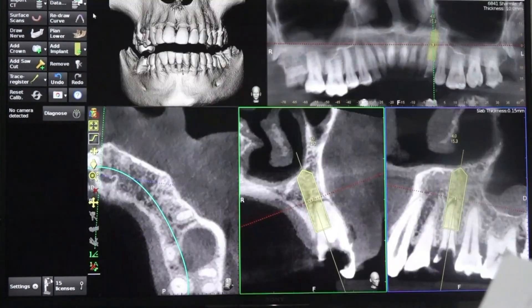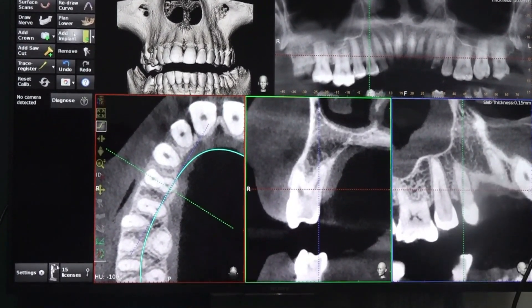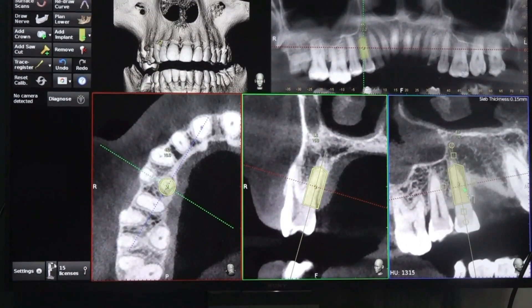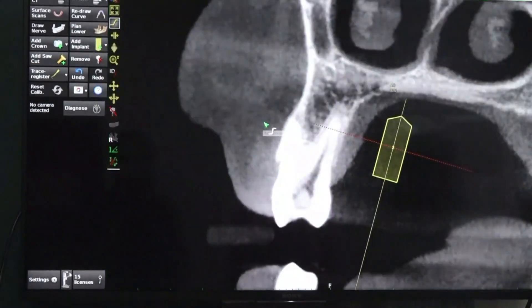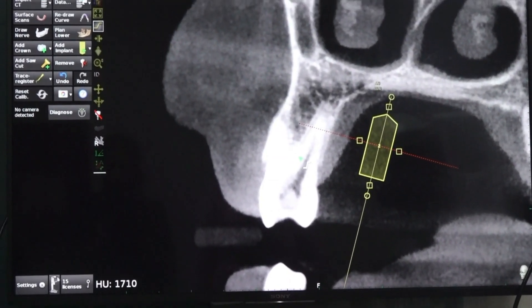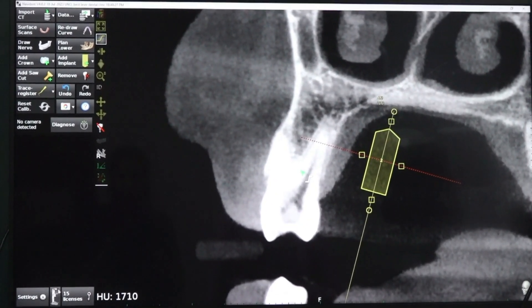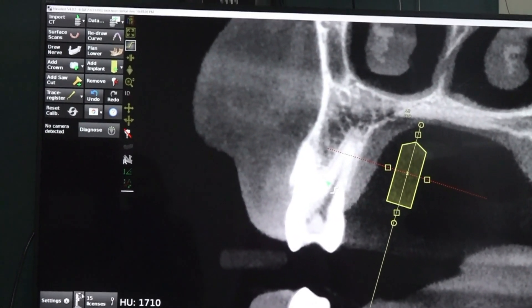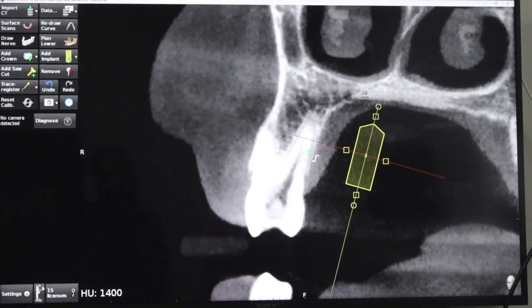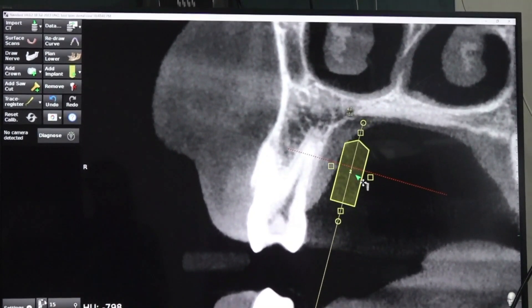Now we will see the 1,4. They are very much separate — beautifully separate from the furcation itself. On the left side, the buccal and palatal root separation happens very near the apex. On the right side you get a clean palatal socket, but on the left it is fused, so we will get a big socket.